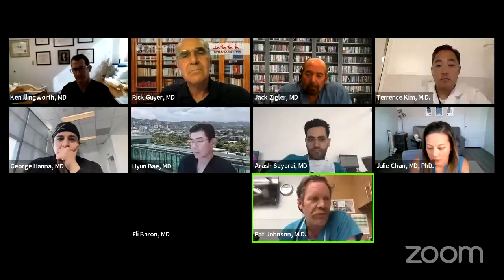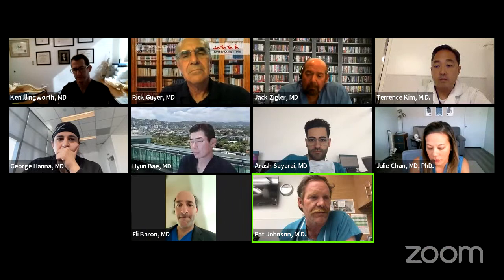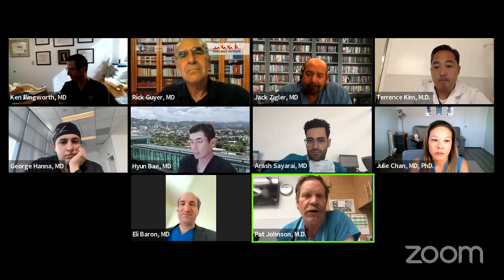The imaging studies, we've had better luck with some of our private imaging centers. They have done a really good job where there is a lot of artifact from the Prestige discs, and they have gotten to where they can image them pretty darn well. So we can see the spinal cord in some of those patients. But that's a problem with a lot of the devices. No matter what they have in them, they all have enough metal that it creates artifact. And I think it comes down to the imaging centers really are going to be able to help us out with that.